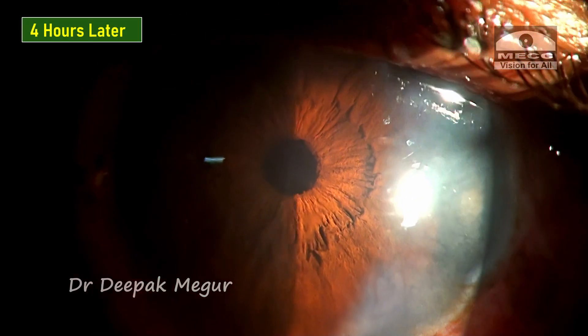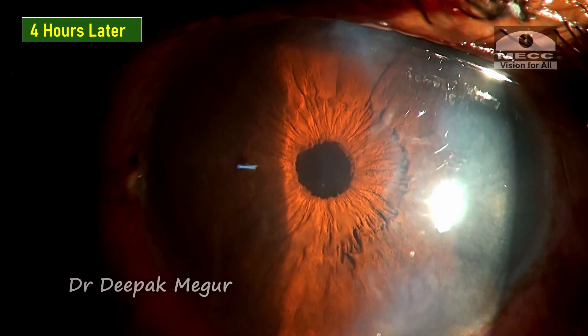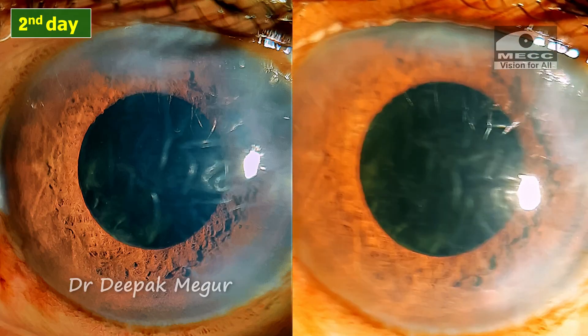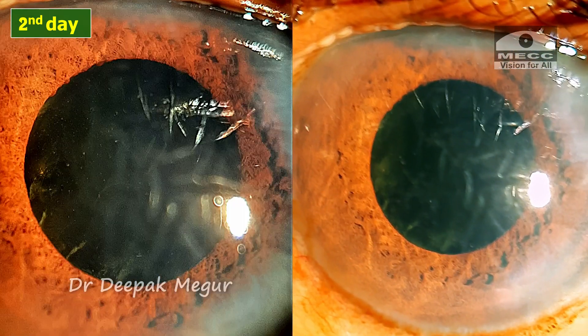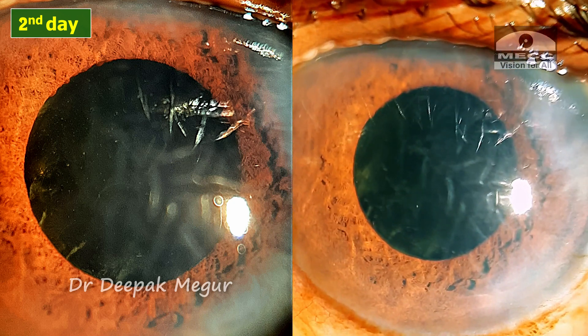Four hours later, the eye looks all right. There is some corneal edema, but the chamber is nice and deep. The intraocular pressures are under control, as I had already prescribed anti-glaucoma medications in anticipation of raised IOP due to retained OVD inside the eye.